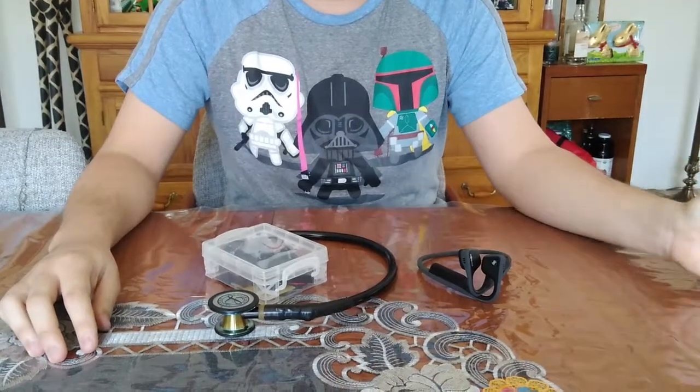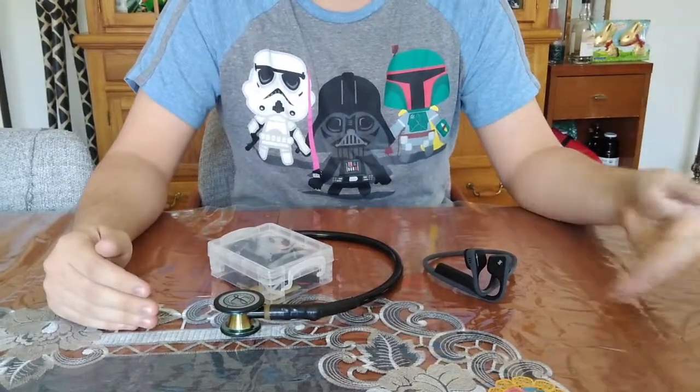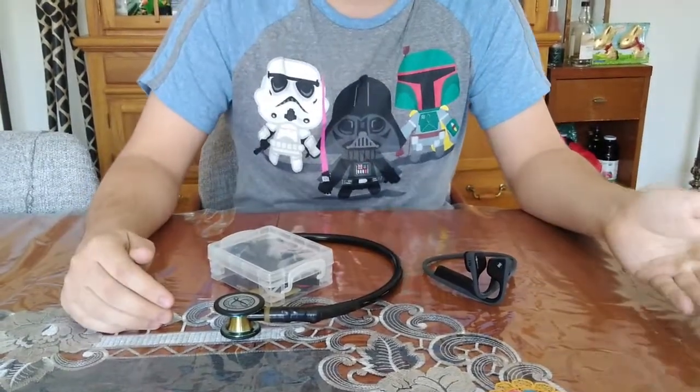You can hear heart sounds, lung sounds, stomach sounds. It has many uses, and it is a very well-known and well-used tool.